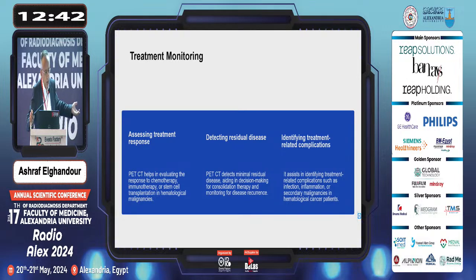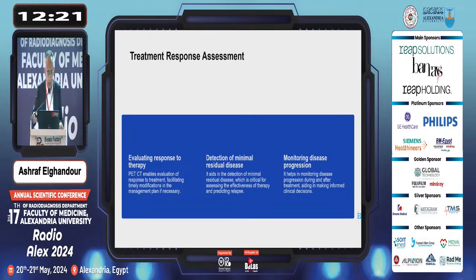As treatment monitoring, yes, I treat monitoring as assessing treatment response and detecting residual disease. Actually here in Egypt, in Hodgkin's lymphoma, you follow most internationals at PET-2, interim analysis of PET-2 in Hodgkin's lymphomas, but in non-Hodgkin lymphoma, it's PET-3 and sometimes PET-4 in low-grade lymphomas. I used to do it. Actually, I need to evaluate PET-CT for response, minimal residual disease, and monitoring of progression.